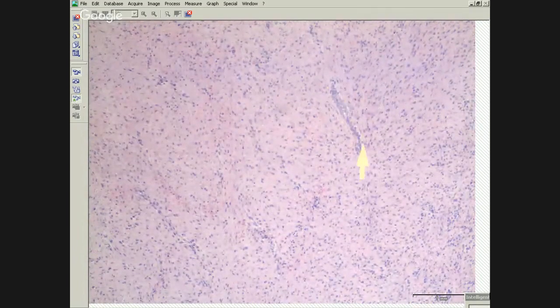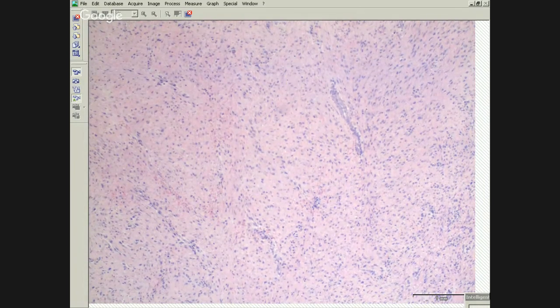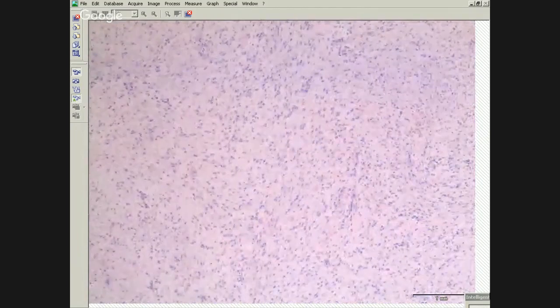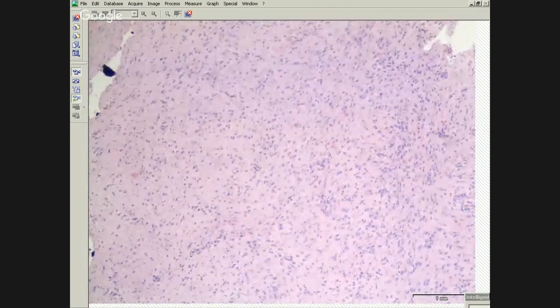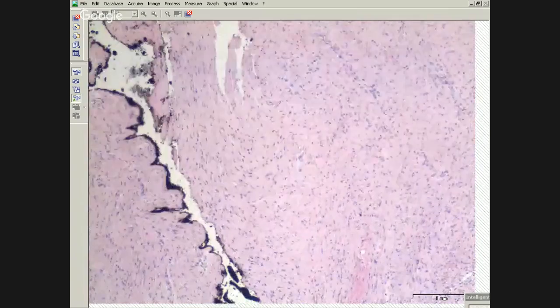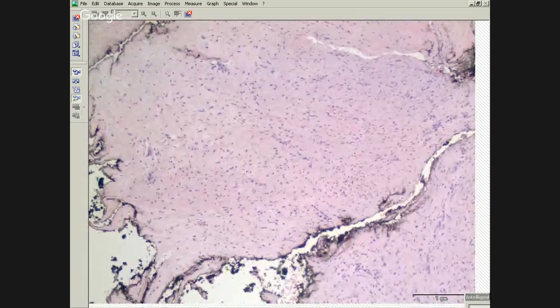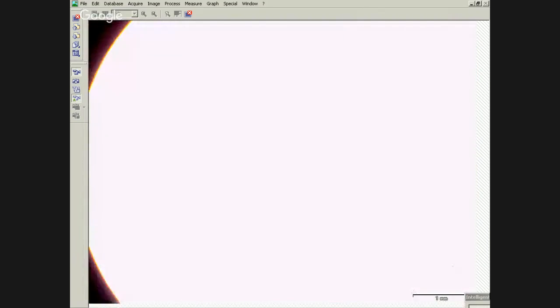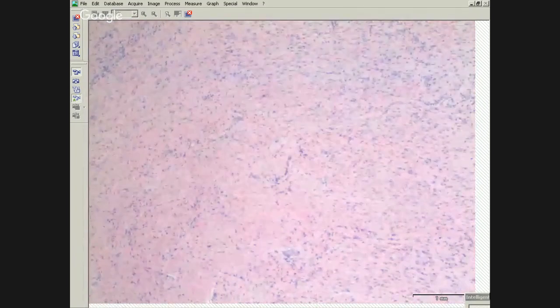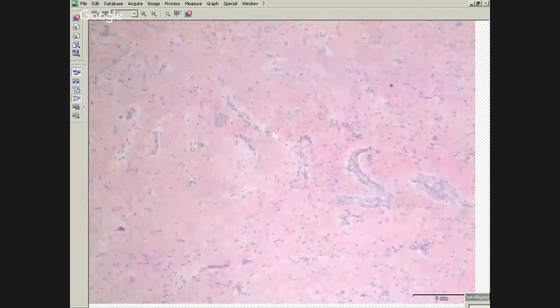You don't have those quote unquote hemangiopericytomatous blood vessels that you would expect with solitary fibrous tumor. In the background collagen, you've got fibrous tissue, but you don't have that ropey wire-like collagen. And solitary fibrous tumors tend to be pretty well circumscribed, and even though this is fragmented, you can appreciate that it transitions from areas of cellularity and is infiltrating the soft tissue.